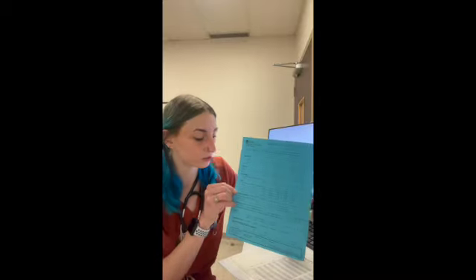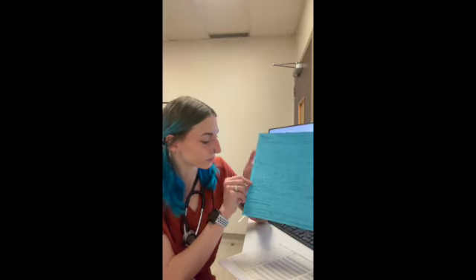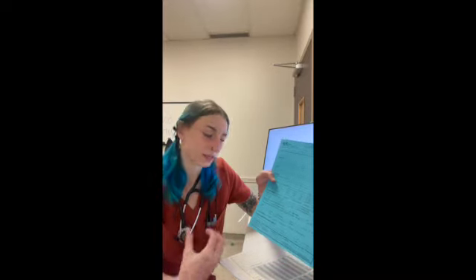So then we're also going to go ahead and add on any CRIs that we may want during our procedure. So any analgesia, or hopefully not, but any pressors that may be needed as well. And there's also a section for local or regional blocks. For this patient, they will not need a local block just because of where the mass is located.